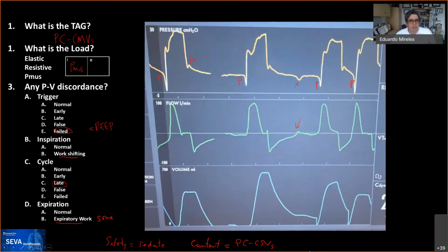Somebody thought that this was adaptive. What would you say to that, Steve? I guess I don't feel like I could say for sure that it's not, but I don't know if I can say for sure that it is. Because it's possible that there's a change in the pressure, but it's also possible it's just the ventilator's difficulty in controlling it precisely. Yeah, it's challenging. I like to always see my volume waveform. You can see that the next one, he almost got 700. The next breath, he got less tidal volume, but the pressure, at least between this one and this one, seems to have pressurized at the same level. But I agree, it's hard to read that.